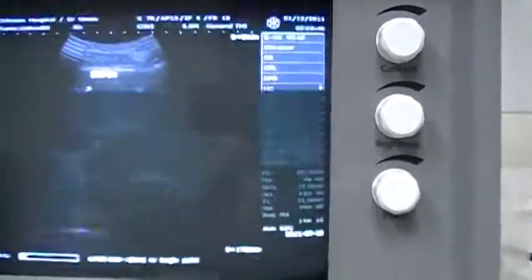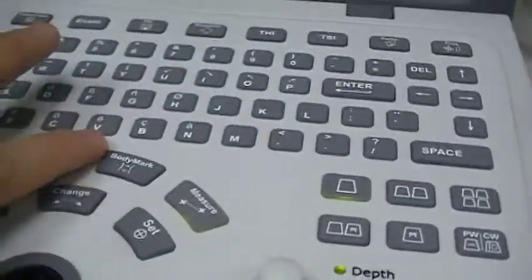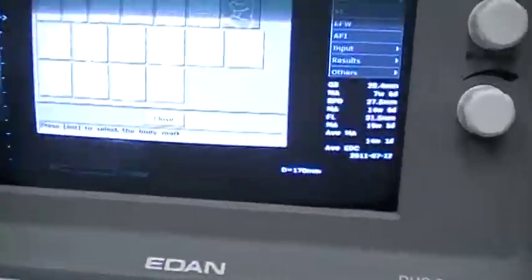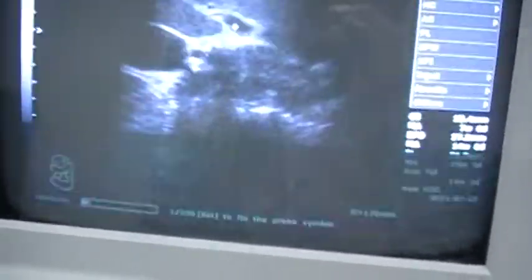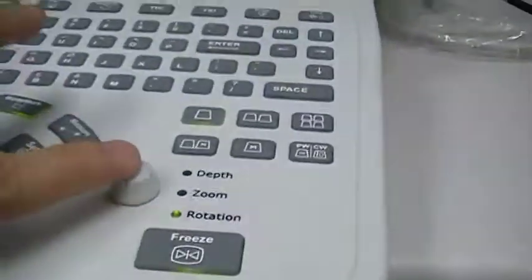Now measurement and comments are done. Press the Body Mark button, then select a body symbol. Move the cursor to the position where you actually placed the probe on the body, then rotate the key to get the correct direction of the probe. Once you are satisfied with the position and direction, press to confirm.